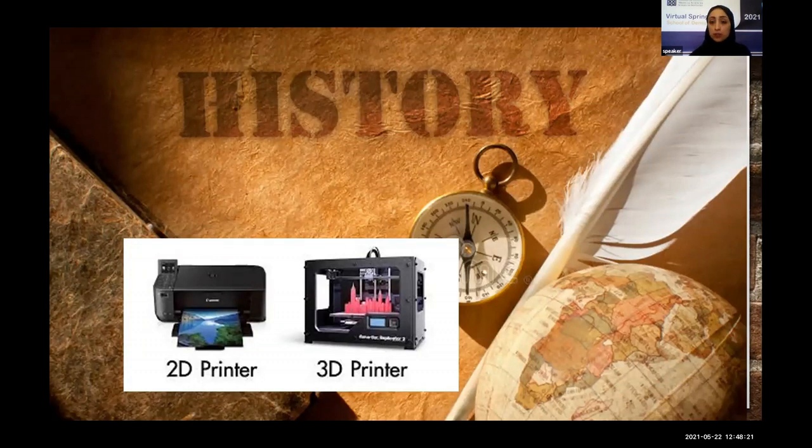The concept of 3D printing can be traced back to the invention of 2D inkjet printers. Rather than ink being deposited onto paper for 2D printing, 3D printers use a variety of materials to create 3D objects from a digital file.